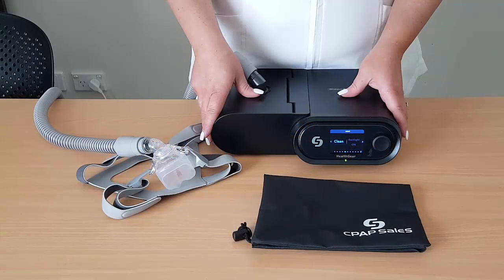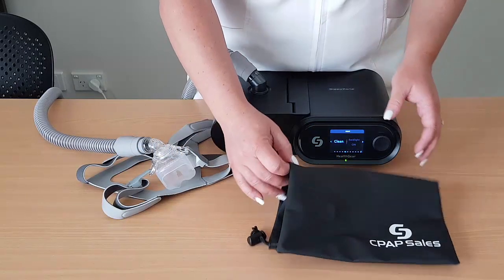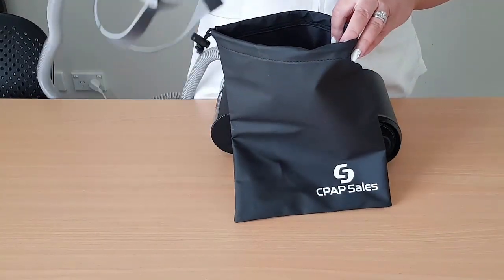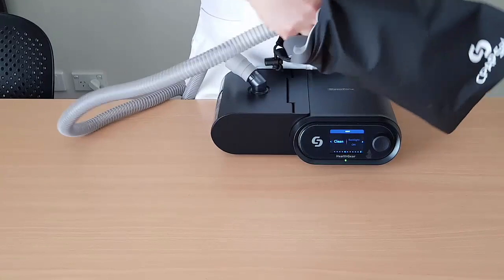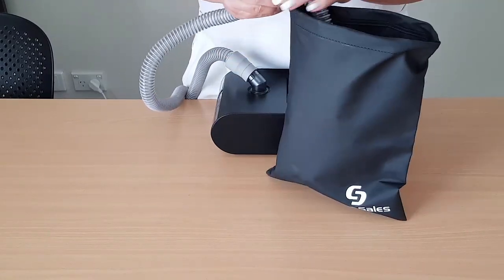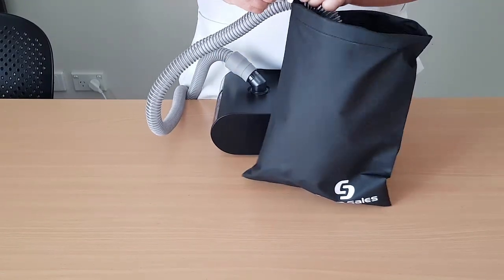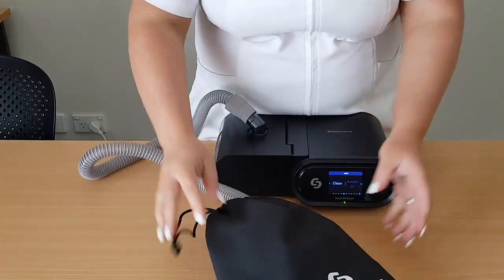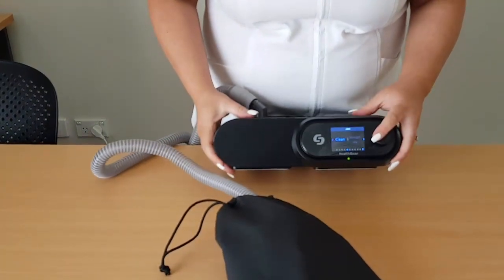This feature can also be used to clean your mask. Take your mask and use the mask bag provided. Pop your mask in and pull tight the drawstring, then follow the on-screen prompts.